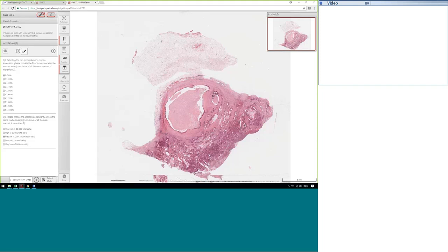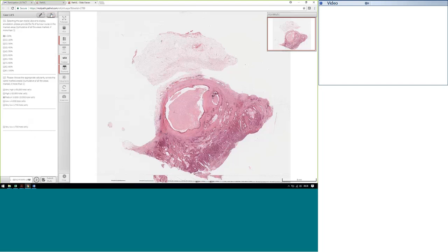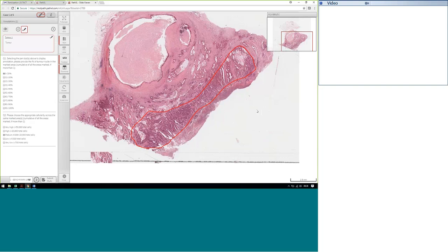I'll now pass you over to Perry and Jane, and we can discuss the cases. Thank you very much, Sandy. This is the first case, which is the benchmark case, showing the annotated area. This is the benchmark case which suggests to the participants an area which has been annotated for microdissection.